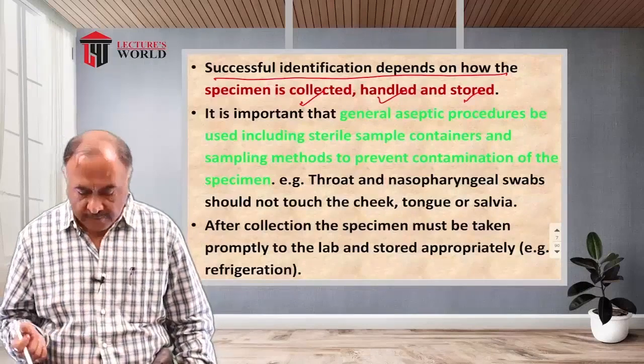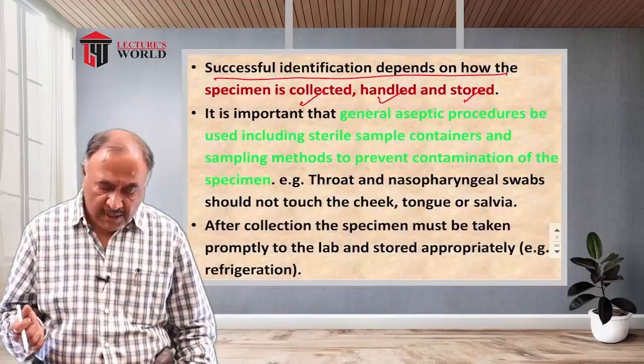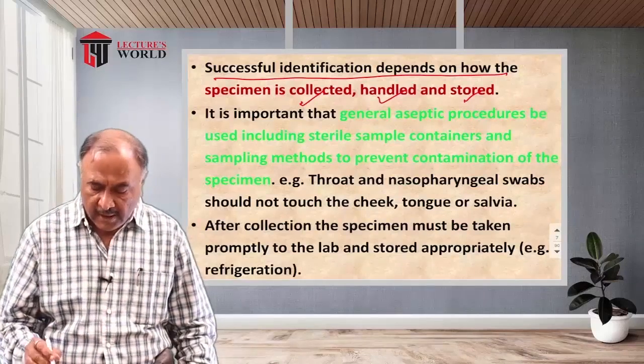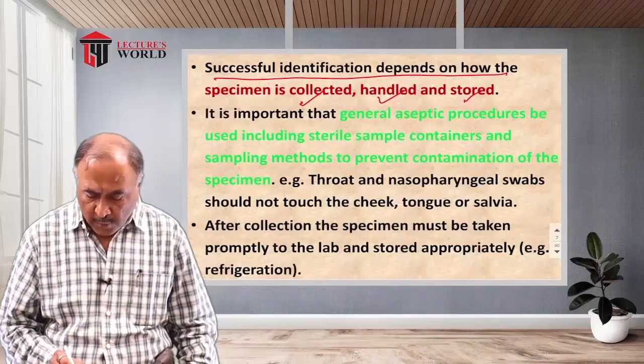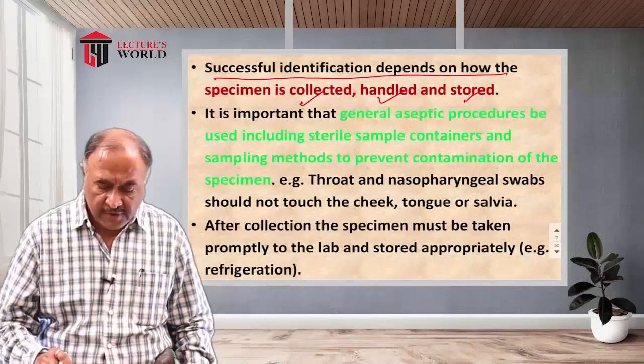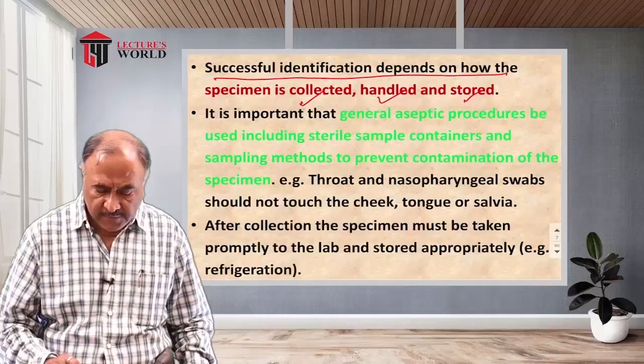After the collection, the specimen has to be promptly taken to the laboratory and stored appropriately, mostly in refrigeration, that is at a low temperature.